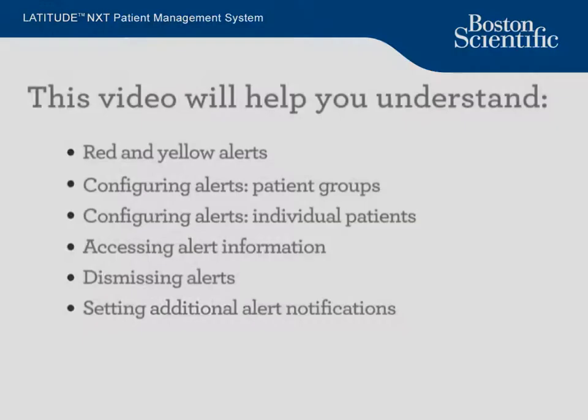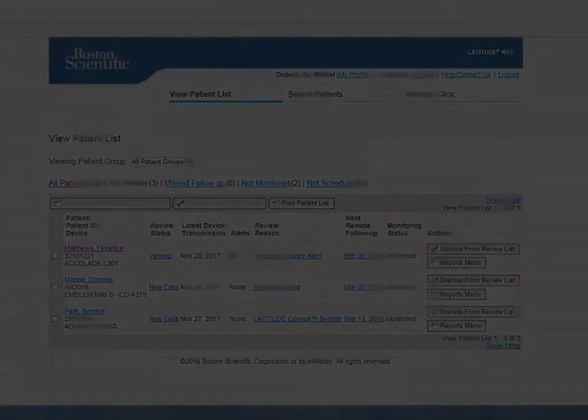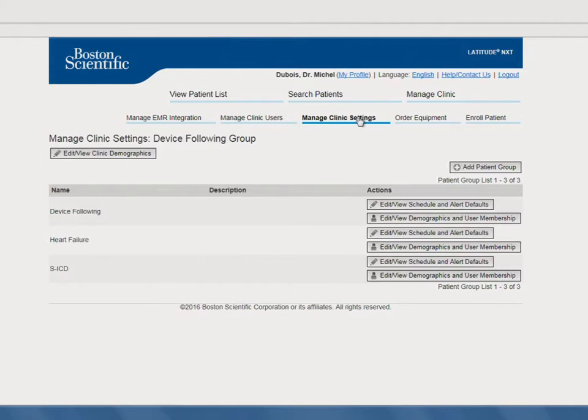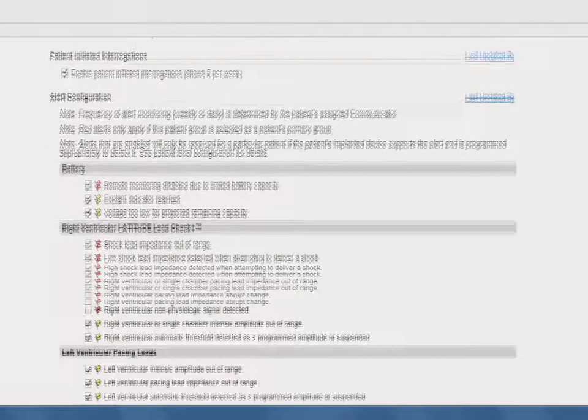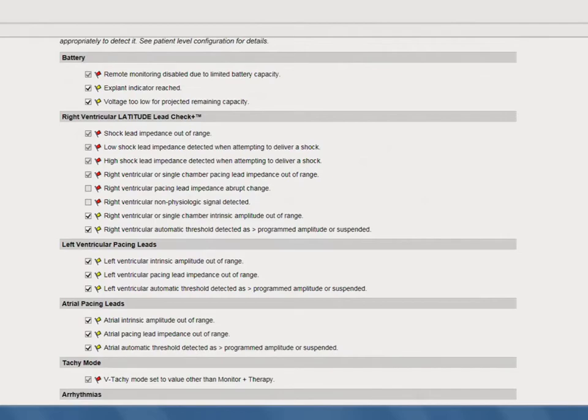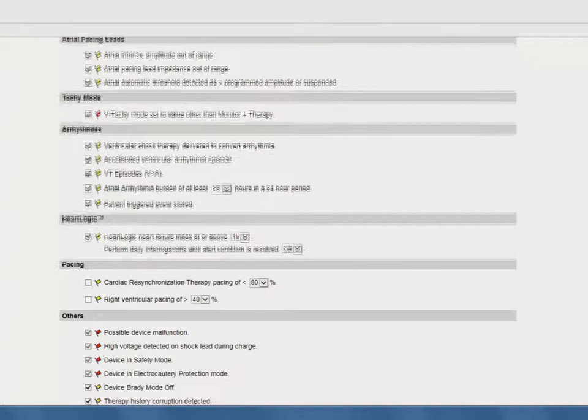Now we'll show you how to configure alerts for patient groups. Simply hover over Manage Clinic and click Manage Clinic Settings. Click Edit View Schedule and Alert Defaults next to the patient group whose alert configuration you want to change. Make sure the checkbox is selected for each of the alerts you want to be notified of for patients in this group. This is also the screen where you can select the limit for those applicable yellow alerts. Once you're satisfied with your alert selections and configurations, scroll down and click Save and Close.